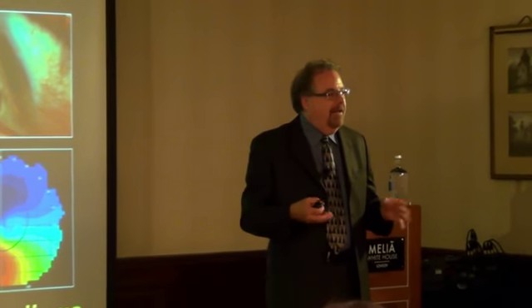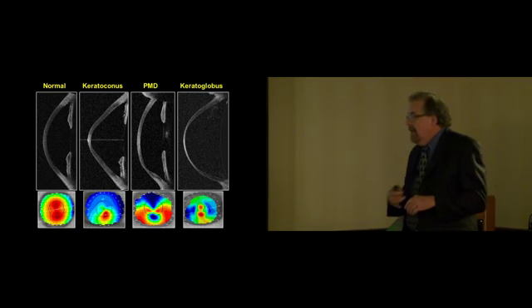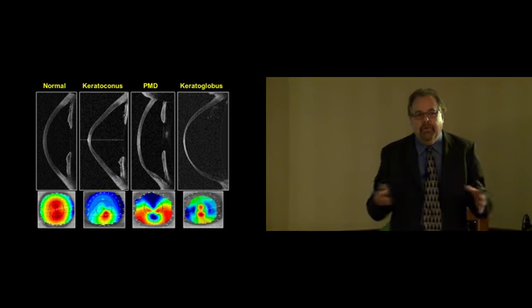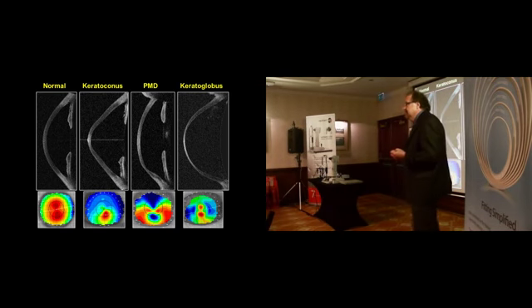We've got some new thoughts about scleral contact lenses, how they fit into the practice, and how we're going to be utilizing them in practice. Today, all of us in clinical practice are faced with a wide range of corneal topographies that we need to manage somehow with rigid contact lenses.